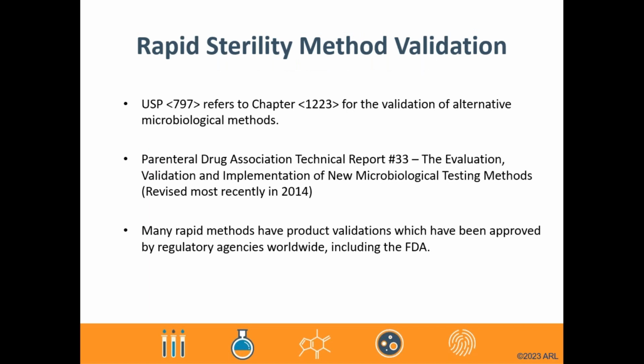So moving on to the next portion of today's webinar, perhaps the most important facet of employing a rapid sterility method is confirmation that a thorough method validation protocol has been completed. All of the systems mentioned during the previous slides have undergone full validations by their respective vendors, as well as by numerous labs around the world.